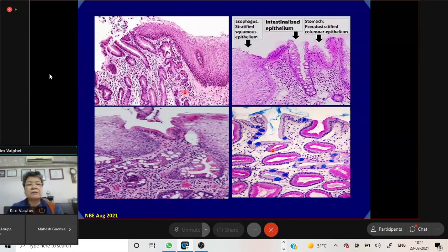And now coming again to the more severe changes of reflux esophagitis, which is the development of columnar lined esophageal mucosa. This columnar lined esophageal mucosa could be of the gastric type, that is a mucus type of epithelial cells, or it could be associated with goblet cells. As one can see here, a lot of scattered goblet cells are intermixed with other types of mucus type epithelial cells, along with changes of reflux esophagitis in the adjoining mucosa.